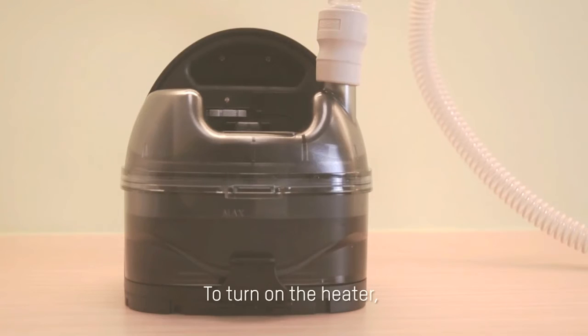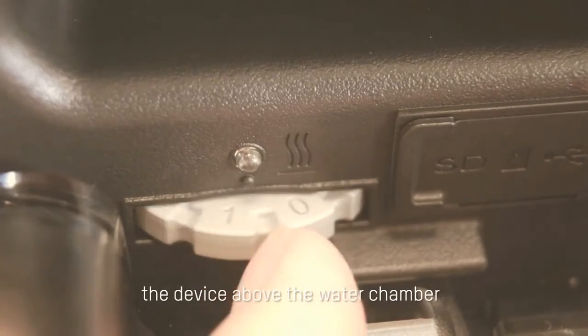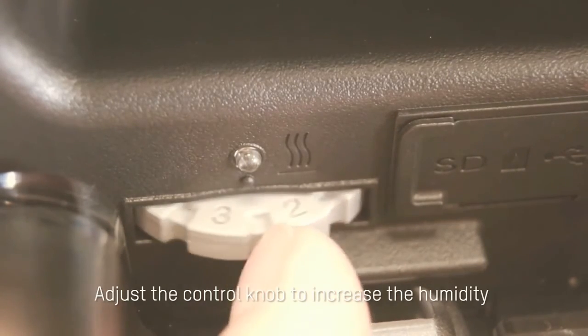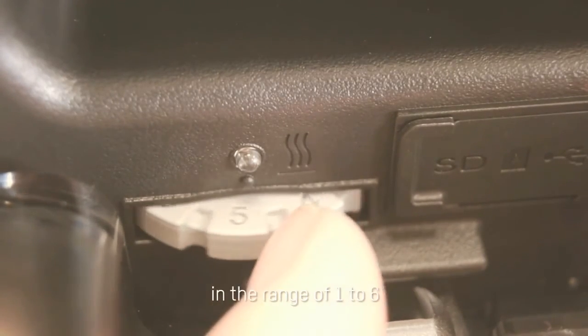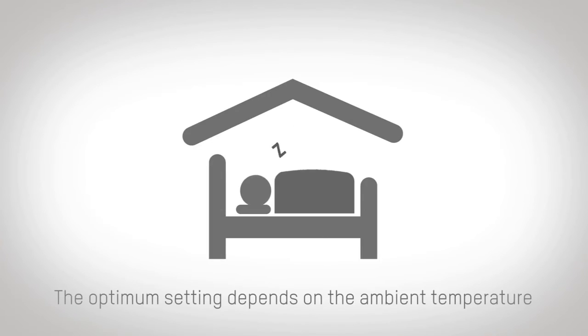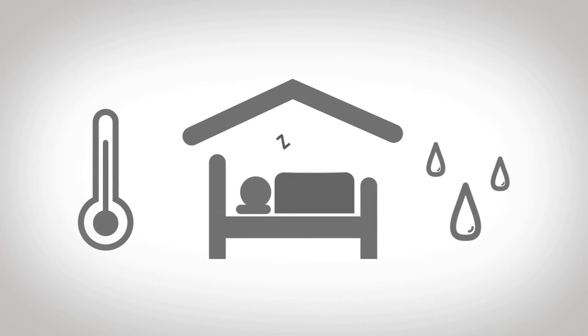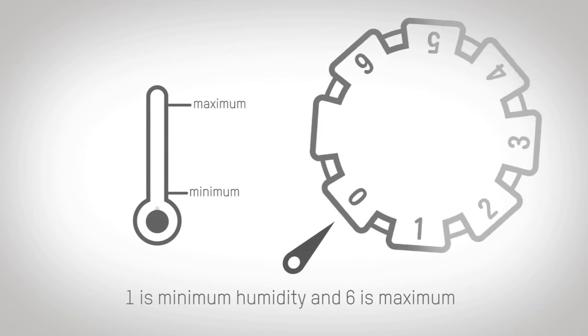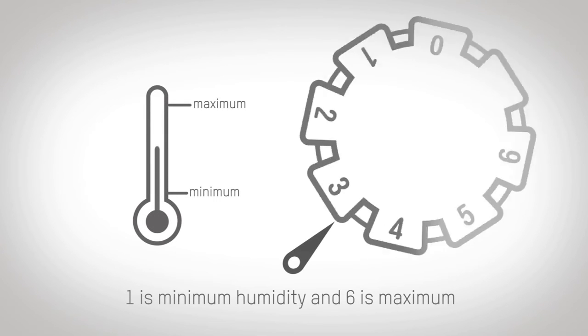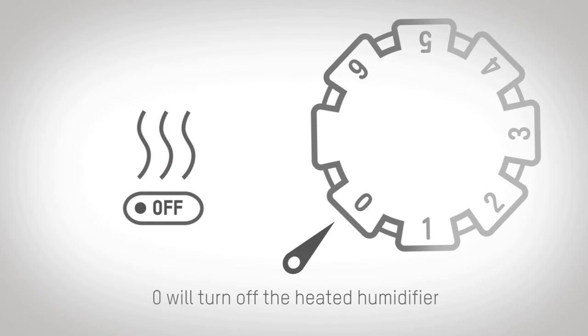Using the Heated Humidifier. To turn on the heater, locate the heat control dial on the back of the device above the water chamber. Adjust the control knob to increase the humidity in the range of 1 to 6. The optimum setting depends on the ambient temperature and humidity of the room. 1 is minimum humidity and 6 is maximum. 0 will turn off the heated humidifier.